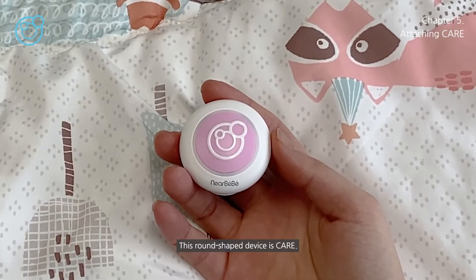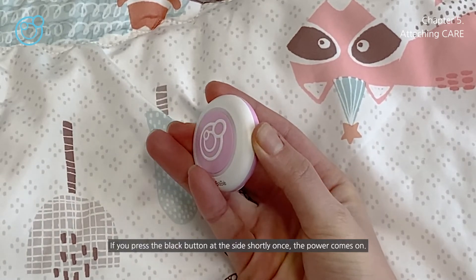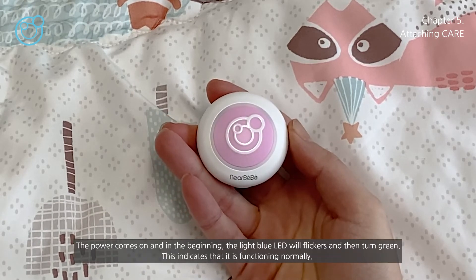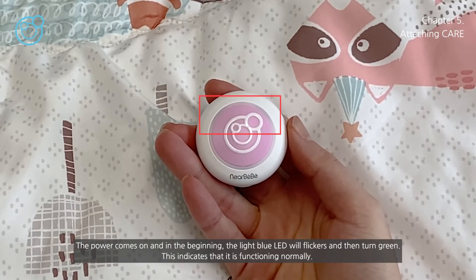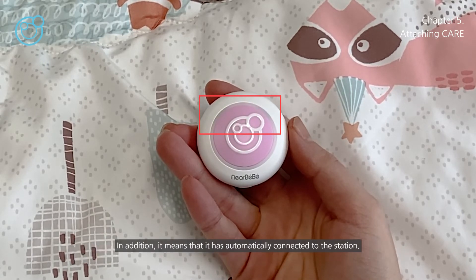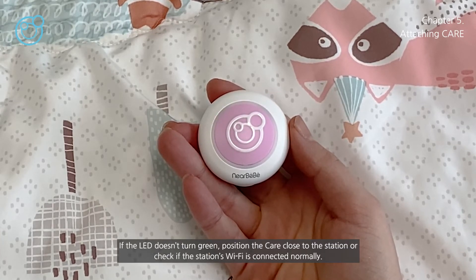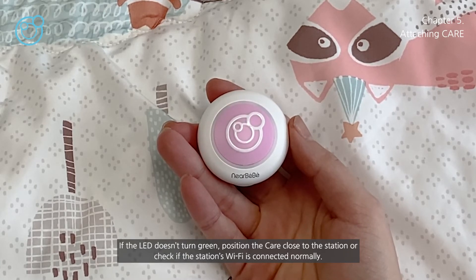This round-shaped device is care. If you press the black button at the side shortly once, the power comes on. The light blue LED will flicker and then turn green, indicating that it is functioning normally and has automatically connected to the station. If the LED doesn't turn green, position the care close to the station, or check if the station's Wi-Fi is connected normally.